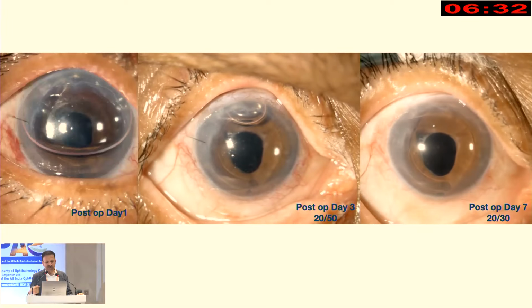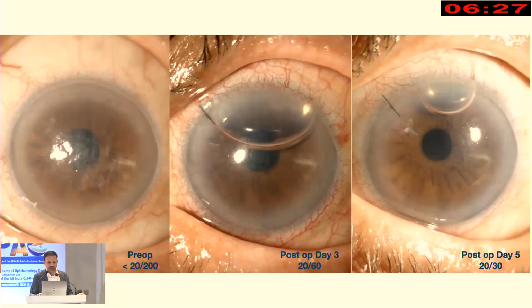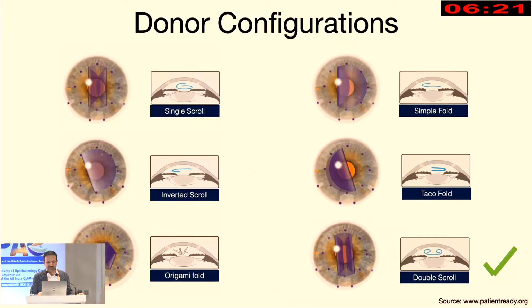So that's the same patient with the endo-in pull-through technique, and you can see that the patient does very well. This is another patient. This is the kind of outcome that you see when you do a DMEK.